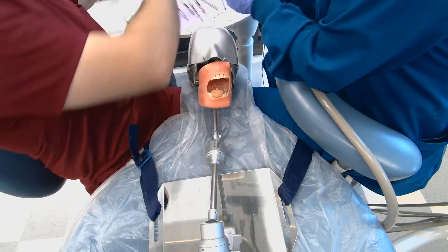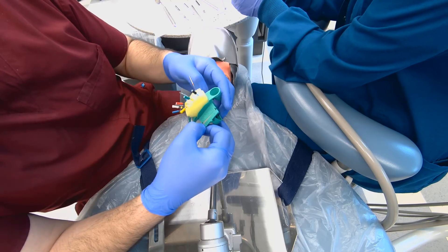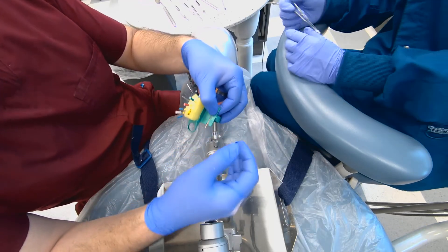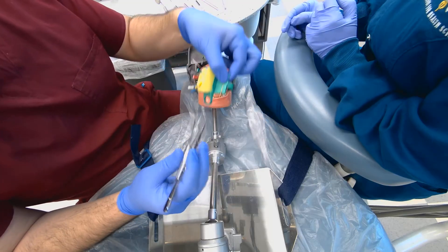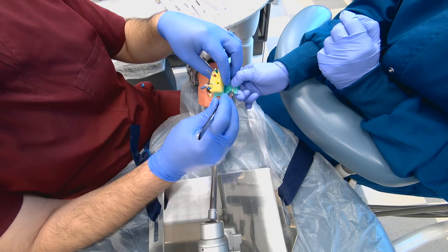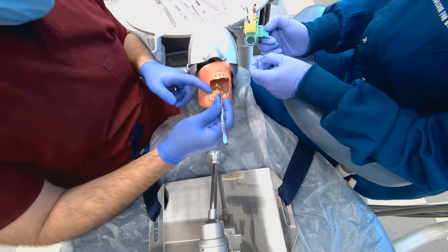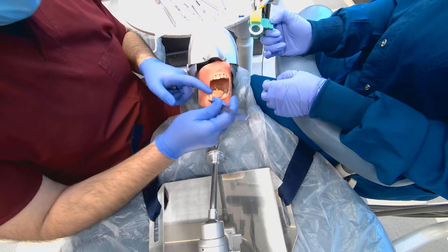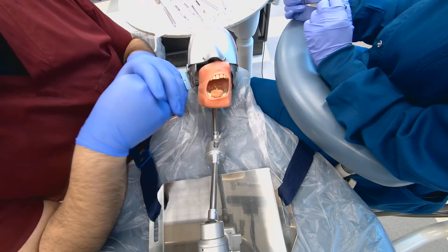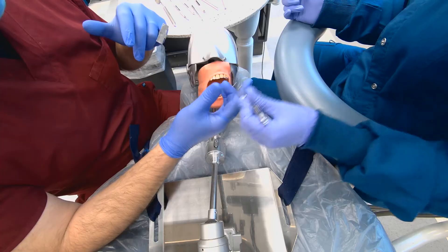The master cone is the first piece that fills in the space and closes the apex. There are different ways to measure it, but you can put it in and lock it — the assistant wears it on their finger, places their thumb, and locks it on the stopper. Bend it slightly to mark the stopping point, then hand it to the dentist. We place the master cone in, take an x-ray to make sure it matches the working length and actually reaches the apex.